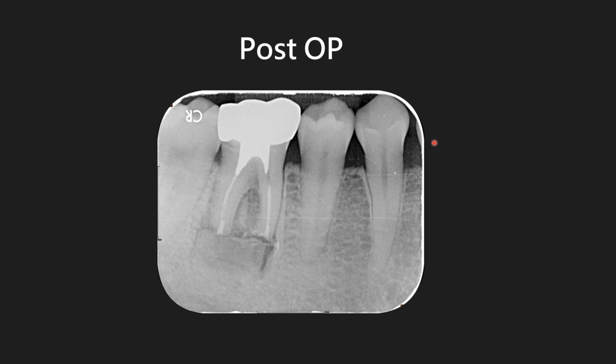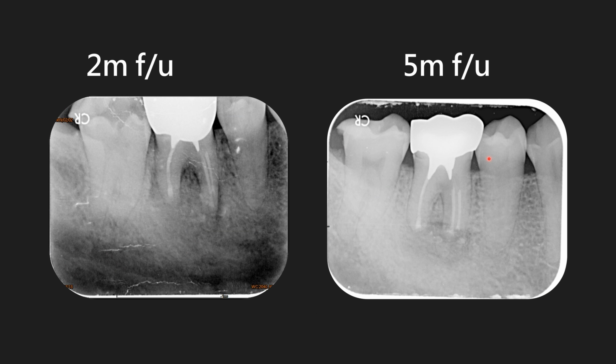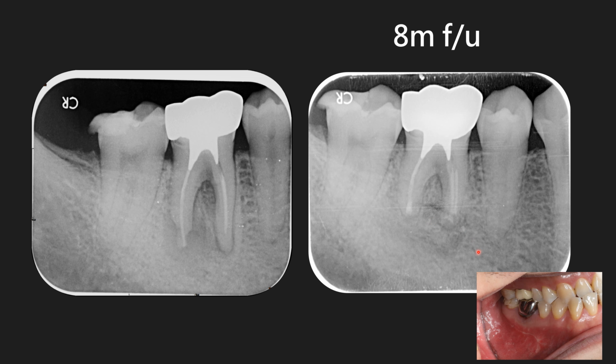And here is the post-op, and I have a 5 months follow-up, which has no symptoms here.